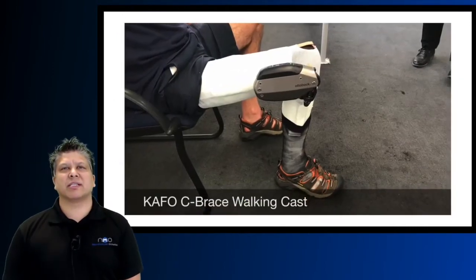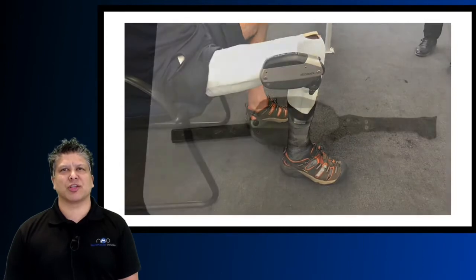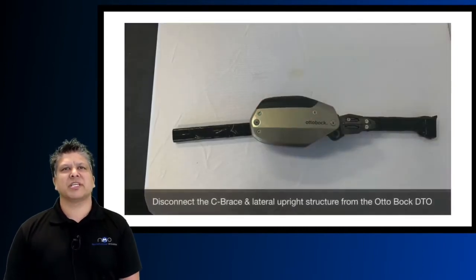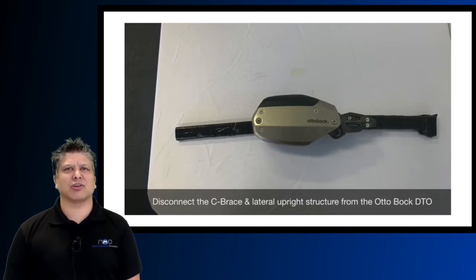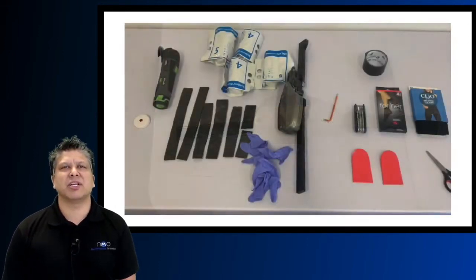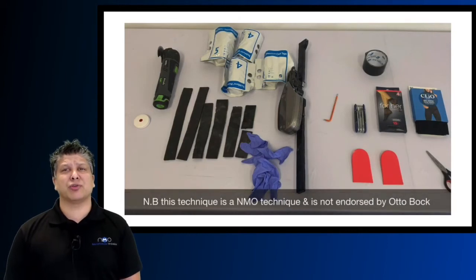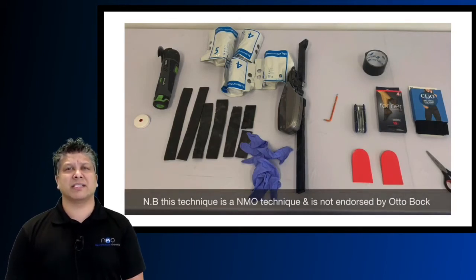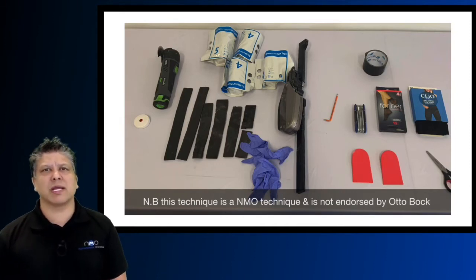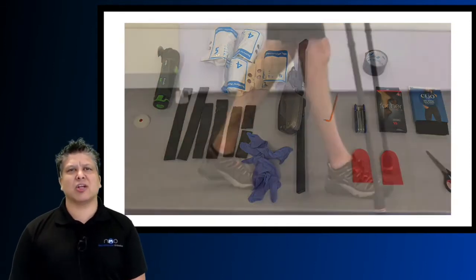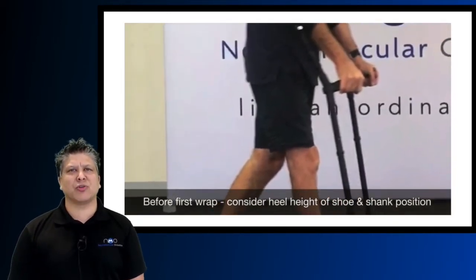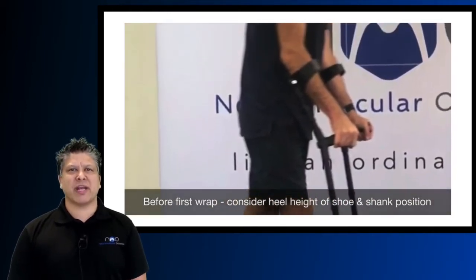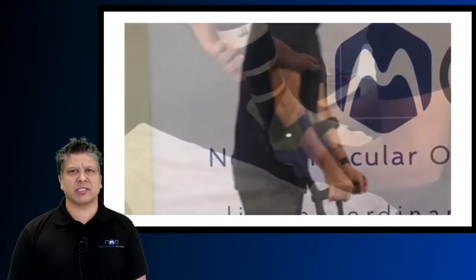For the C-Brace KFO walking cast on Jonathan, the first step is to disconnect the C-Brace and lateral upright from the Ottobock Diagnostic Test Orthosis. Please note this technique is not endorsed by Ottobock and is a neuromuscular orthotic technique. Before starting the walking cast you must consider the heel height of the client's shoe and what shank angle you're casting them in to generate a knee extension moment in the C-Brace in late stance.